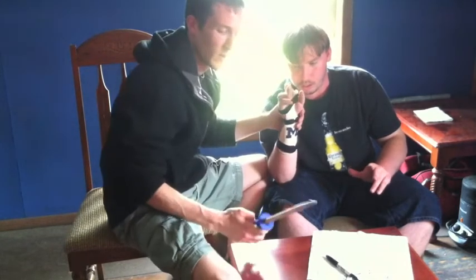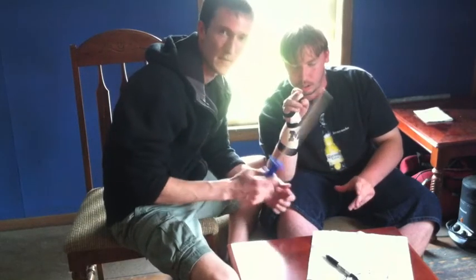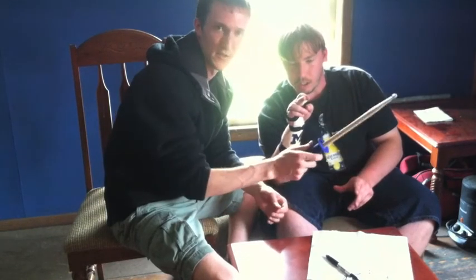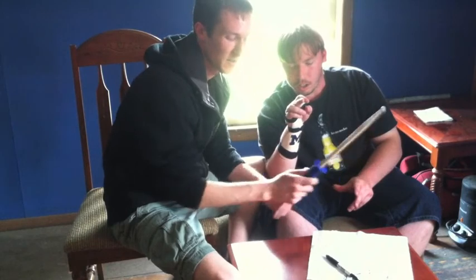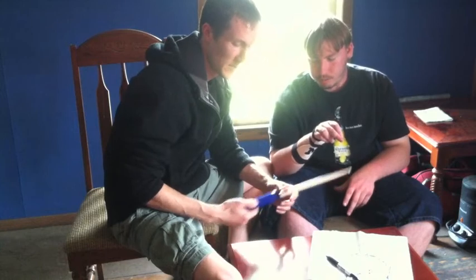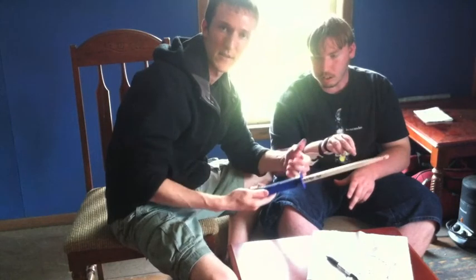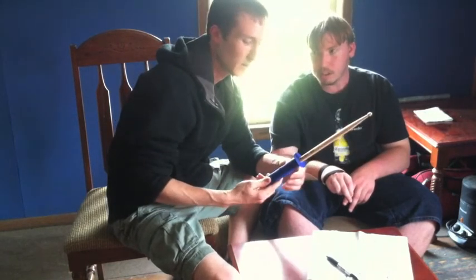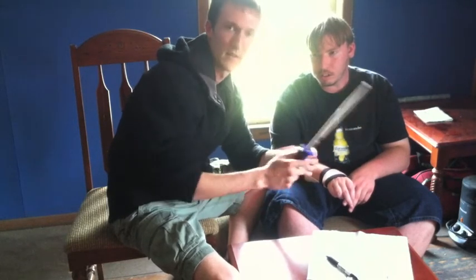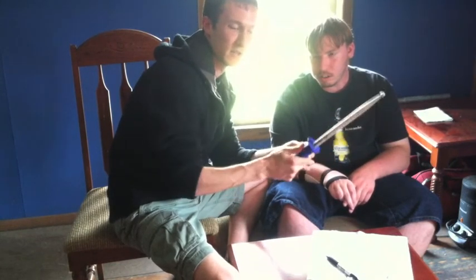Good. Okay. Now what we use for a drumstick, just a regular old drumstick, and once again remember Nick had a harder time just hanging on or gripping the drumstick. And primarily with the drumstick we just use a cylindrical grasp or power grasp. In this instance he's going to have a little bit more lateral stance with the thumb on back. And just a quick little adaptation here to the drumstick, we put just a bicycle grip. I purchased these on Amazon for about $9 or $10, and this just increases the surface area around the drumstick, so it's a little bit easier for him to grip, and plus with just the form of this, it prevents slipping.